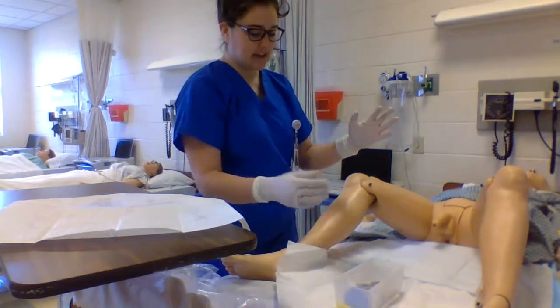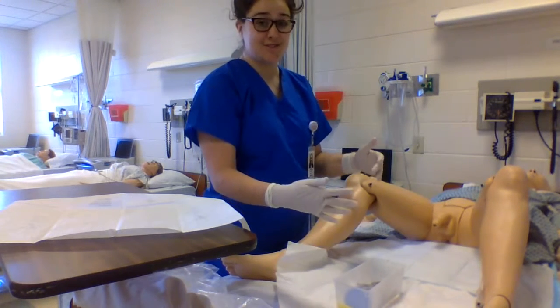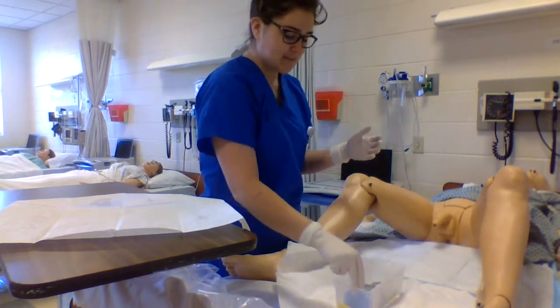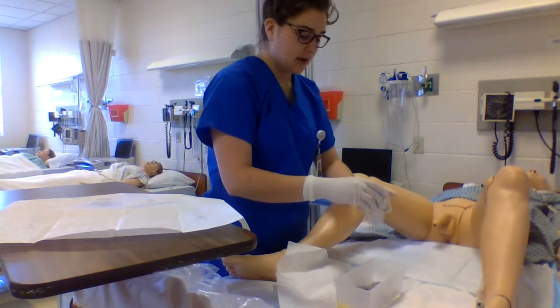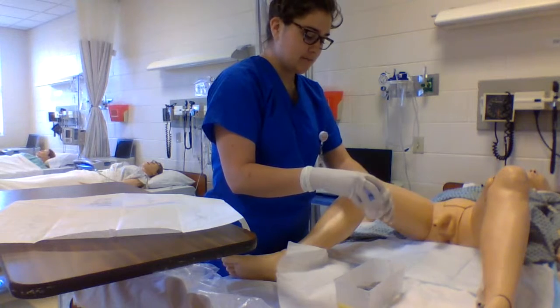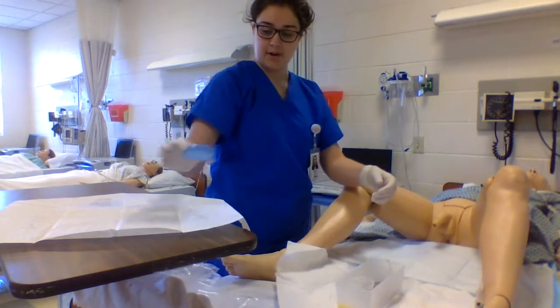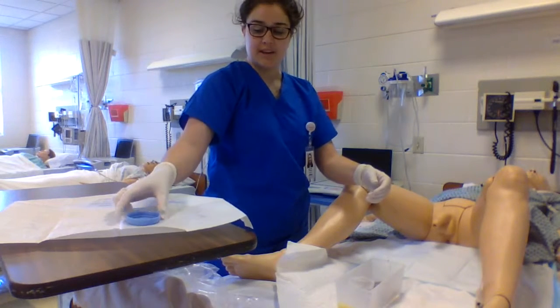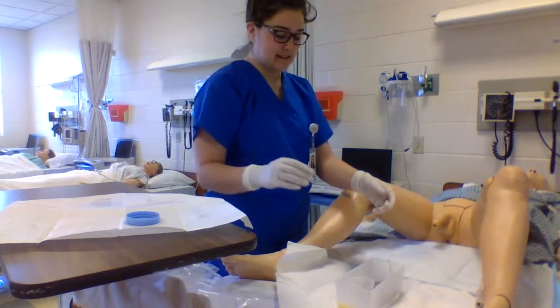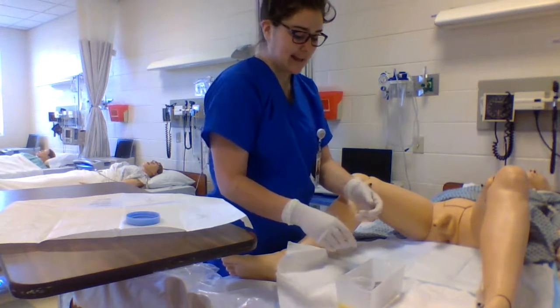I'm going to go ahead and set up everything, and that way all I have to do once I start is just keep one hand. So I'm going to go ahead and open up my culture cup. I'm going to put it up here, which is also a sterile field, and that way I can just set it up on my end table whenever I'm done, so I don't have to try to close it with one hand.